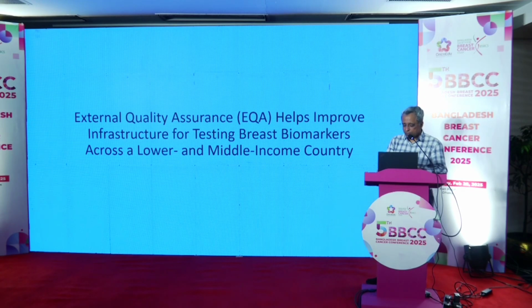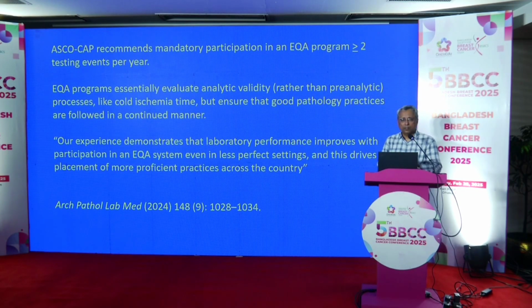For labs that do these predictive biomarkers, ASCO CAP has a recommendation of participating in at least two EQA programs every year, so that's six monthly, right? And it's a good thing to participate in this because it tells you a lot of things about your process, right?